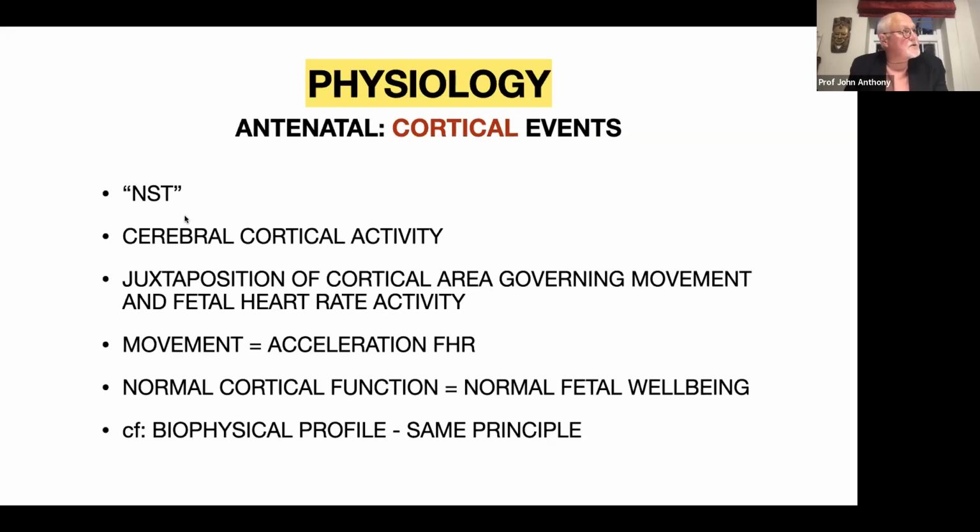And such tracings are usually referred to as non-stress tests, NSTs. And I know that in some parts of the country, there's a tendency to even describe intrapartum tracings as NSTs. Now, that is incorrect. It's simply based on a misunderstanding. NST stands for non-stress test. And we got to this terminology because years ago, there was a tendency among certain people to try and assess fetal placental reserve before the onset of labor by setting up an oxytocin infusion, making the uterus contract, and seeing whether or not there was any change in the fetal heart rate pattern. So that was a CST, and luckily the CST is gone. Nobody does that anymore. But we're left with this term NST, which is a non-stress test.